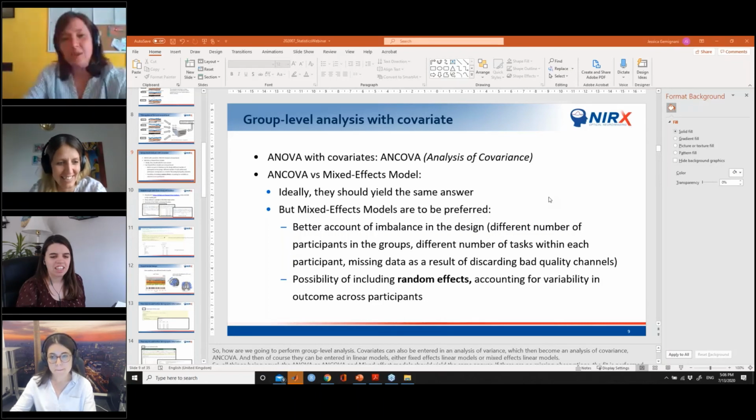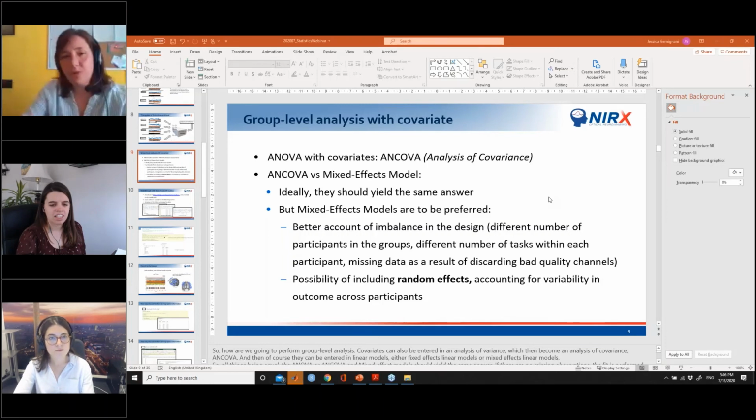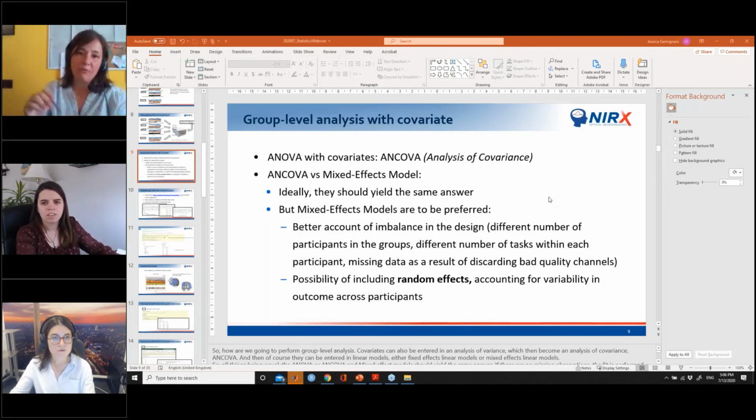Basically, all the variability related to the subject can be modeled with random intercepts and random slopes. With the random intercept, you want to take into account the fact that each individual subject responds differently, has a different starting point, but then the pattern of response to the two conditions is basically the same. In one of the resources that I pointed out, this is explained very well.